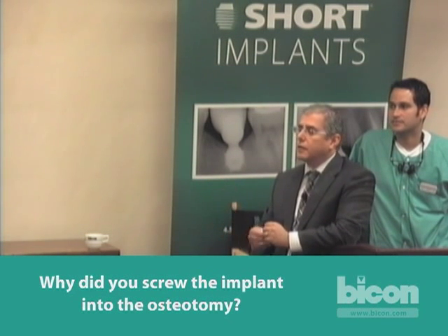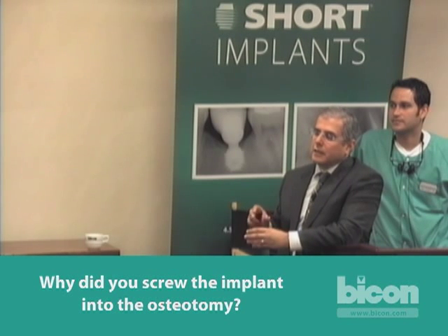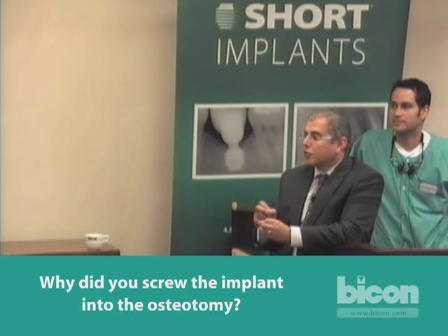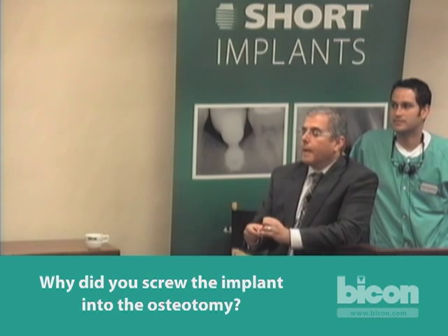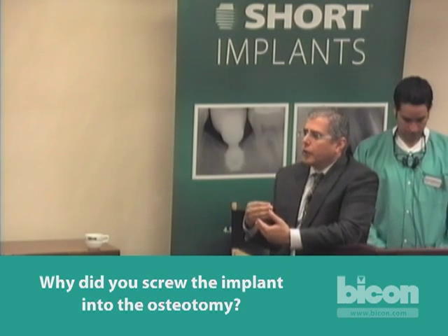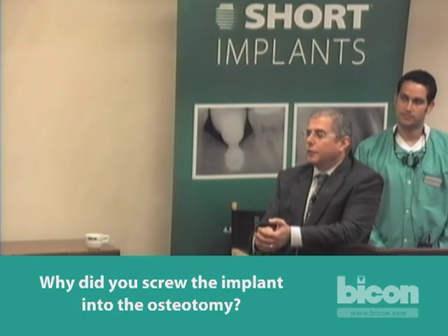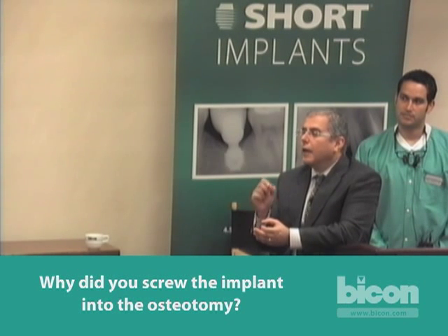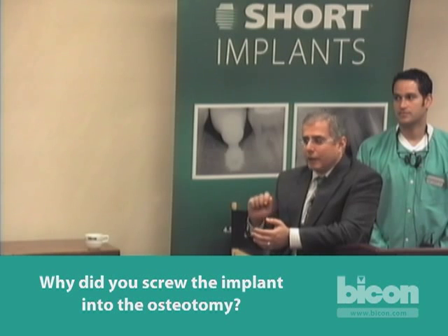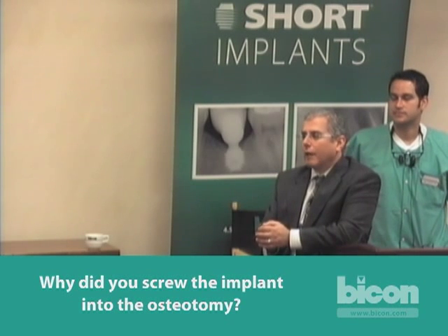The implant doesn't have threads — these are not spiral threads. Screwing it in allows you to mobilize it a little bit, but it's not meant to be seated by twisting. It is meant to be pressed in, either gently or with a little bit of tapping. The question is why tap and not just push it in? Tapping with a very light surgical mallet is a lot gentler than putting your upper body weight behind it, which can force it in very abruptly and you end up with the implant in the sinus. So when in doubt, use a very light tapping with a very light mallet with a very deliberate progression. The implant is not a screw implant — those plateaus are parallel and are meant to go in by friction, not by screwing in.